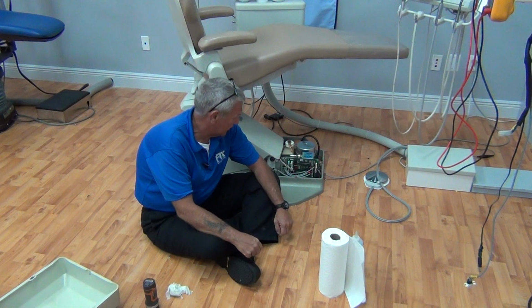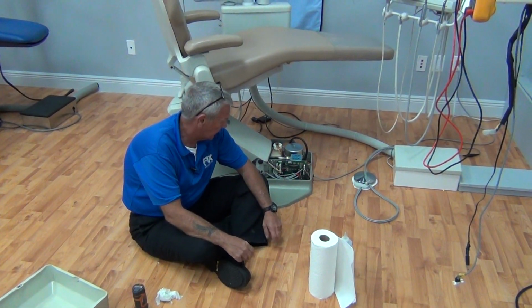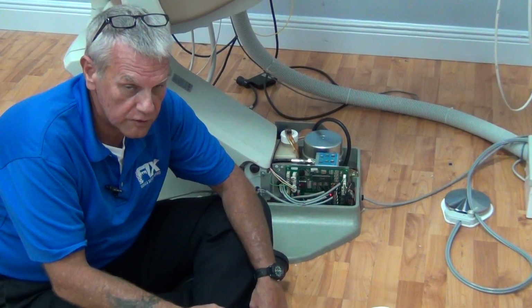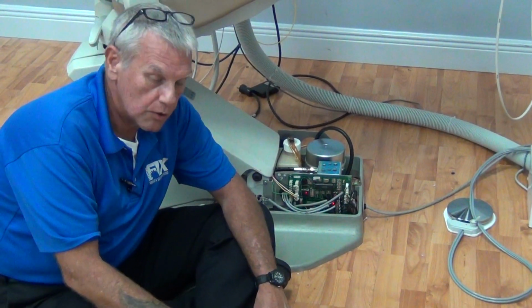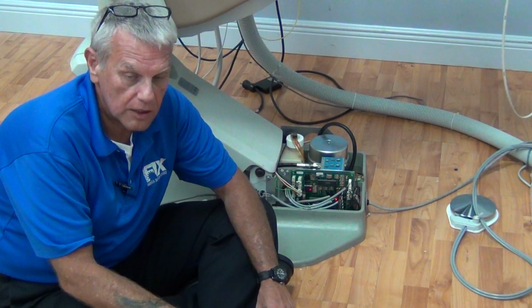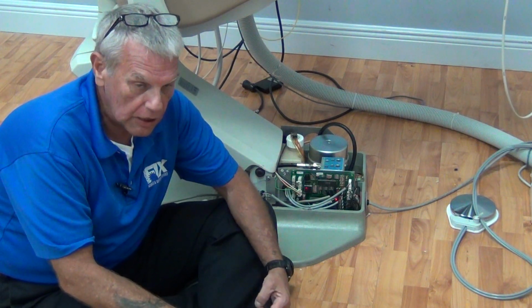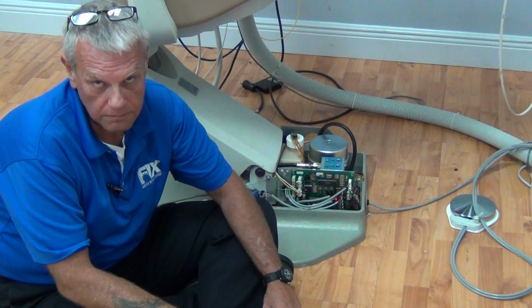Another word about safety, guys. If you don't feel comfortable with this unit plugged in while you're servicing it, unplug it. We're not servicing, we're maintaining. You can do either or. I recommend you unplug it. For ease and speed in the video, I am not going to power down.